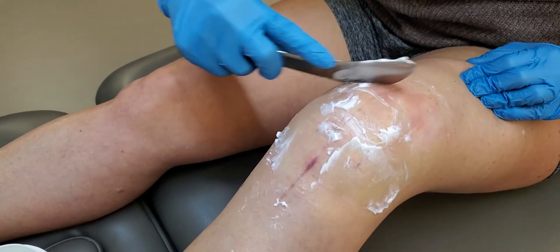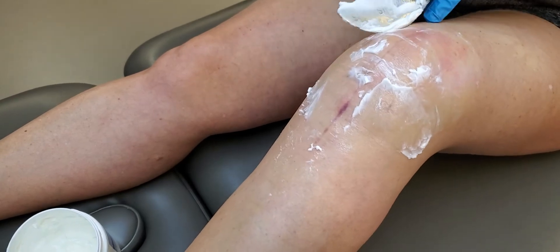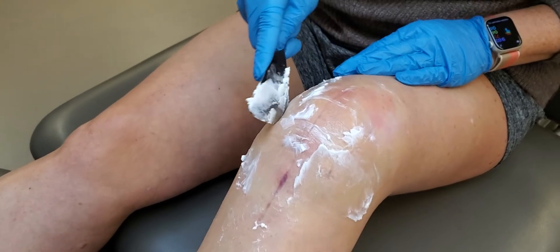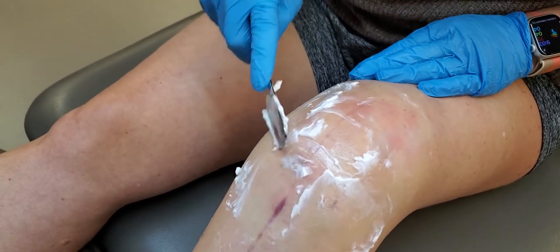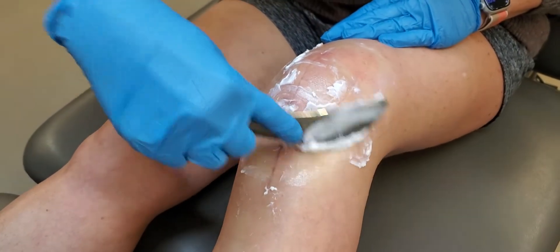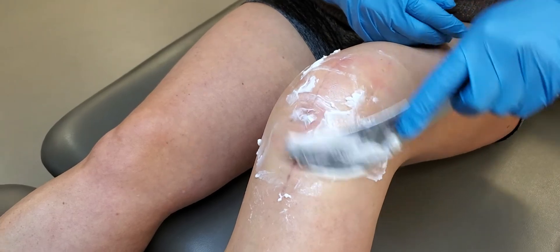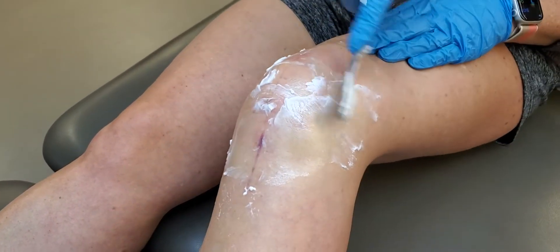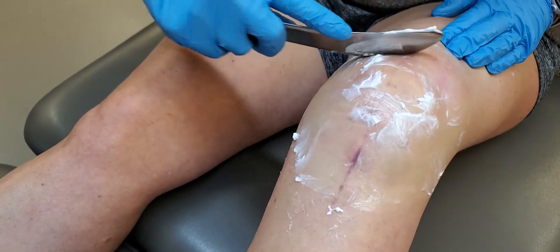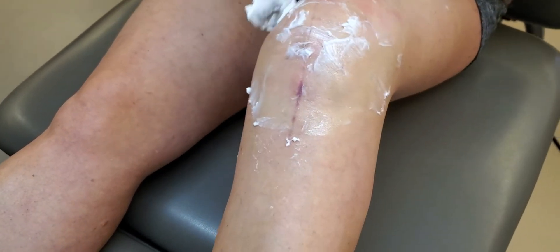Self-application of instrument-assisted soft tissue mobilization for the patellofemoral retinaculum and surrounding tissues. Using some type of lubricant — in this case a massage cream — though coconut oil, Vaseline, or lotions with active ingredients such as an anesthetic component or vitamin A or vitamin E can help with the cosmetic of scar healing.